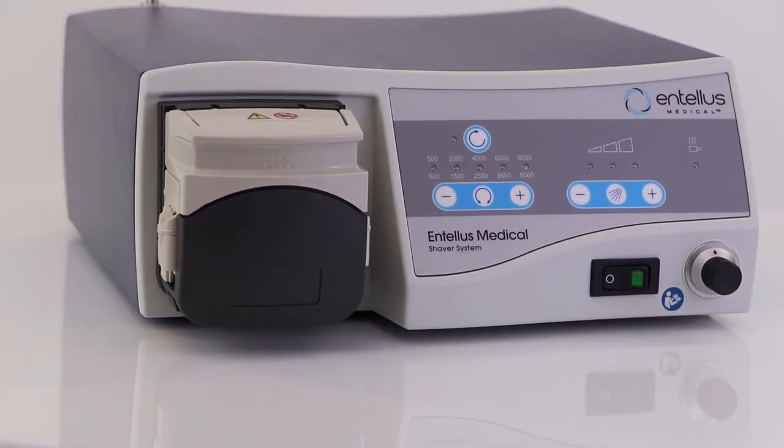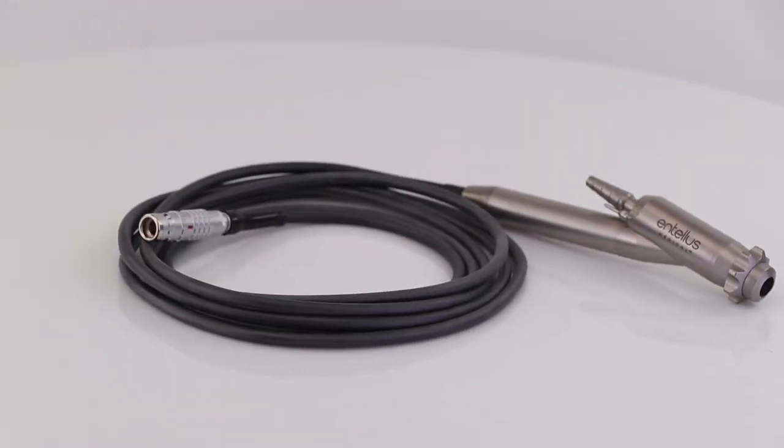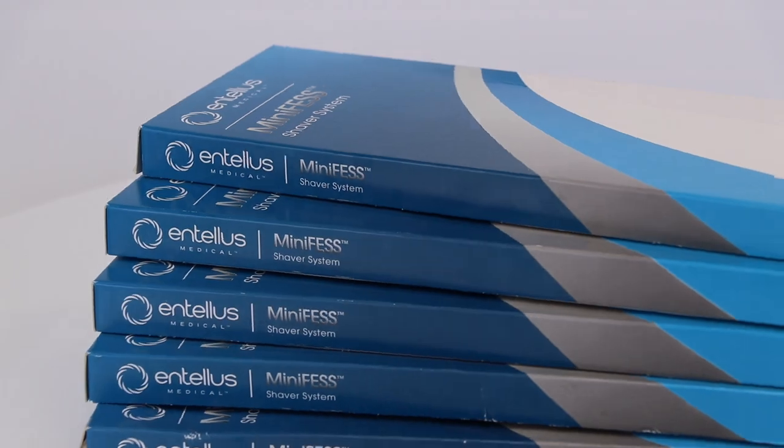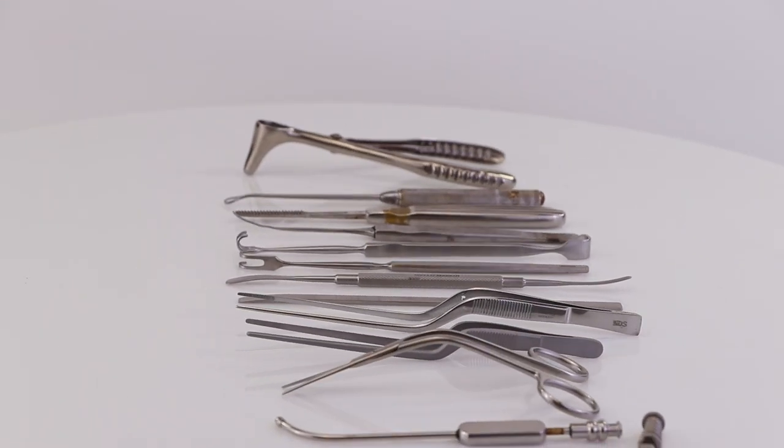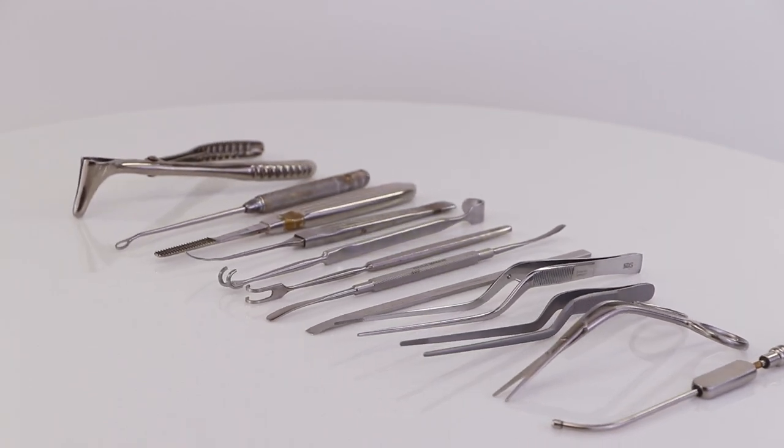It would have your console, your foot pedal, a handpiece, and then some disposable products as well as just a basic nasal instrumentation set.